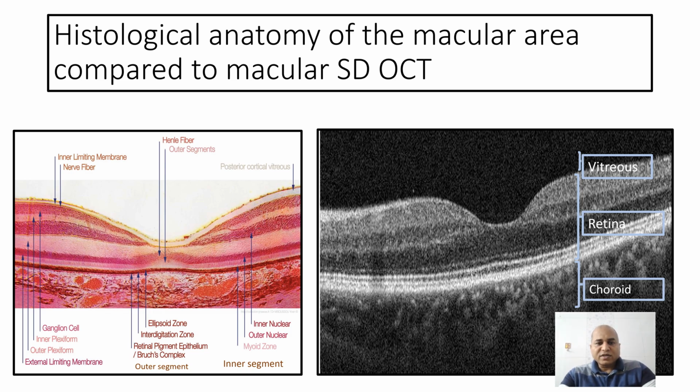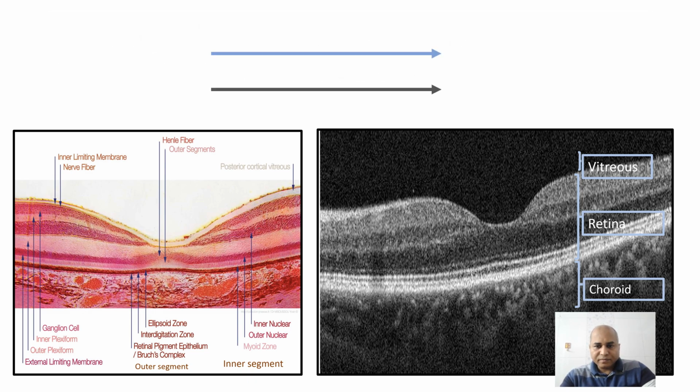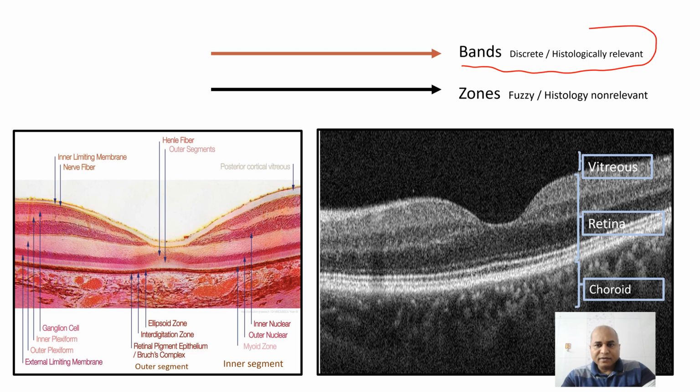Now this is one slide which I had created with a lot of intent, and I want all my students and audience to pay attention to this particular slide. It has so much information to learn. Now I had divided these layers into bands and zones.